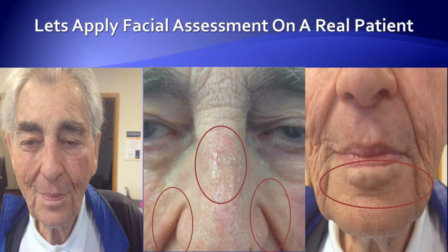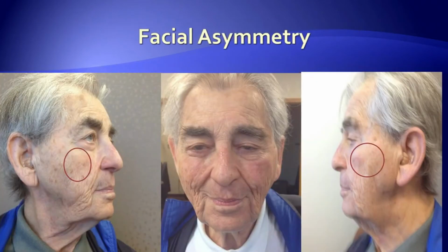They're actually curled around to become folds. Again, another source of air leaks for the mask. Then finally, looking below the lips, you see that it is raised and swollen, and this is above the gum line, so it's like the mask is pushing on the lower part below the lip against the actual teeth.